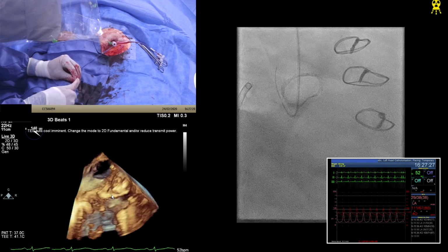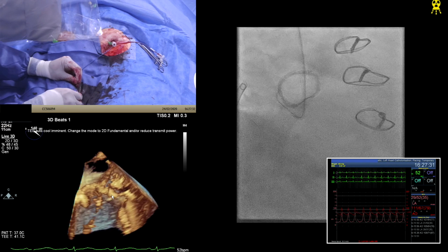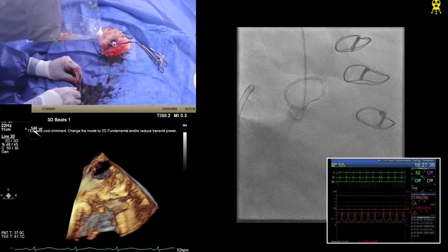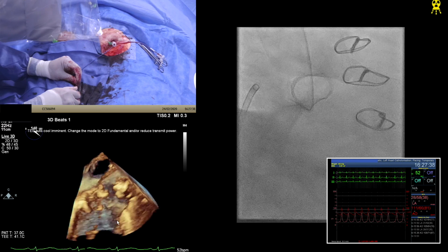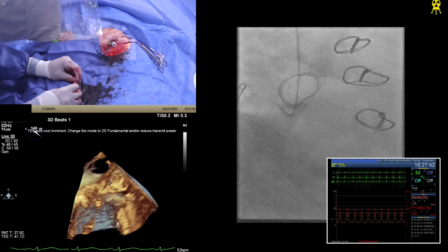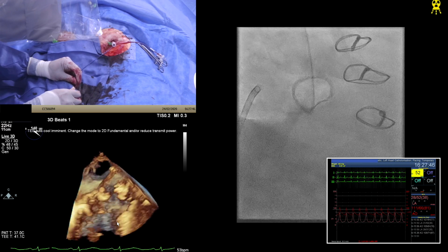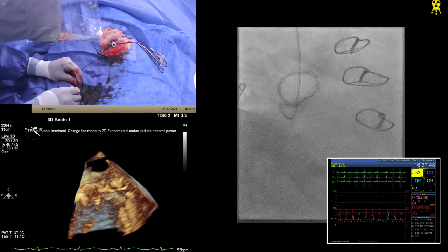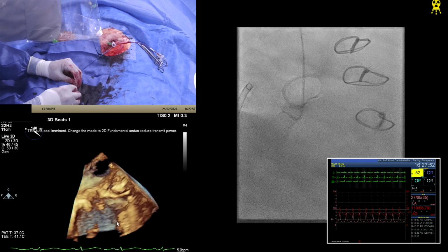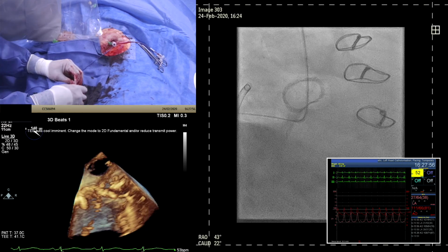Oh God! I think it flicked for a second. I've got the feeling you're so close. The tip is just there, and it's just a case of if you went that way rather than kept going that way. So you see that? If I could get it to keep on going in that very small turn, you see what I'm talking about, Neil? It's just as it goes horizontal. I think you actually prolapsed it. Like, I think there we are. Okay. Yeah, saw it. There we go. Grab that fluoro.